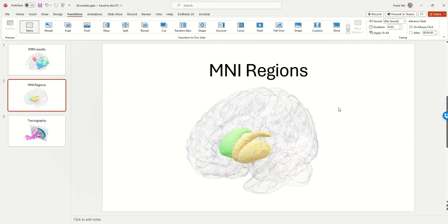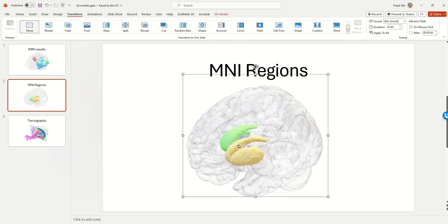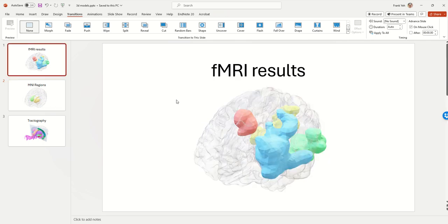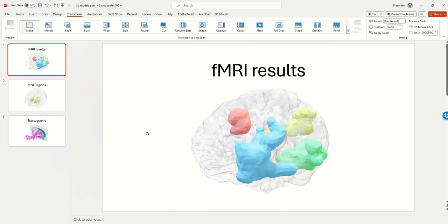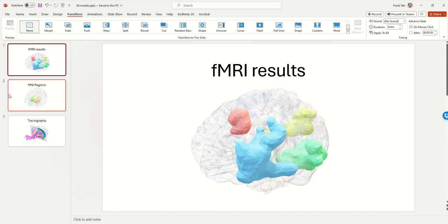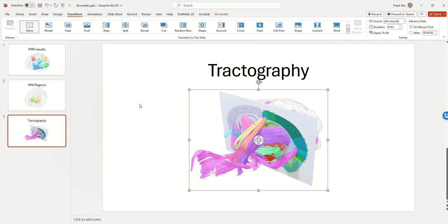In this video I'm going to show you how to embed 3D brain regions in PowerPoint. When you embed these 3D models you can visually inspect and rotate them in a PowerPoint slide, including functional MRI results, MNI regions, or tractography.